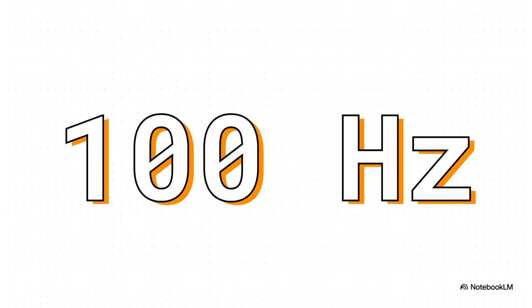When these two meet deep in the tissue, they don't just sit side by side. They actively interfere with each other. By simply subtracting the 4,000 Hz current from the 4,100 Hz current, we get a difference of exactly 100 Hz. And that difference is what we call the beat frequency, or the amplitude modulated frequency. So instead of just irritating the skin on the surface, these medium frequencies bypass that skin resistance and produce this brand new low-frequency therapeutic current deep within the muscle and nerves.